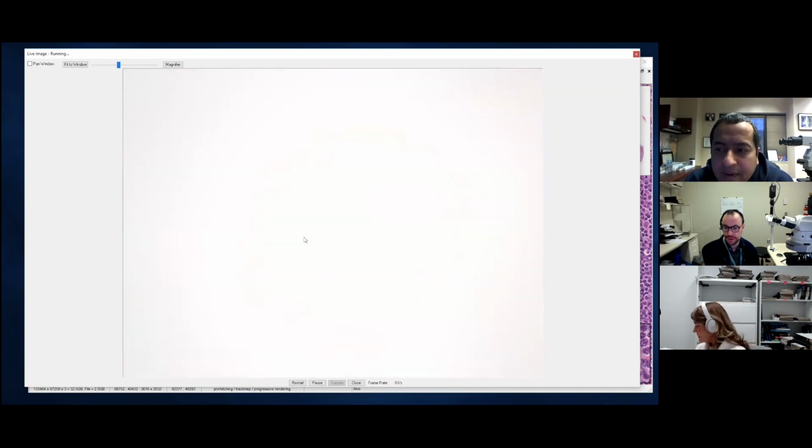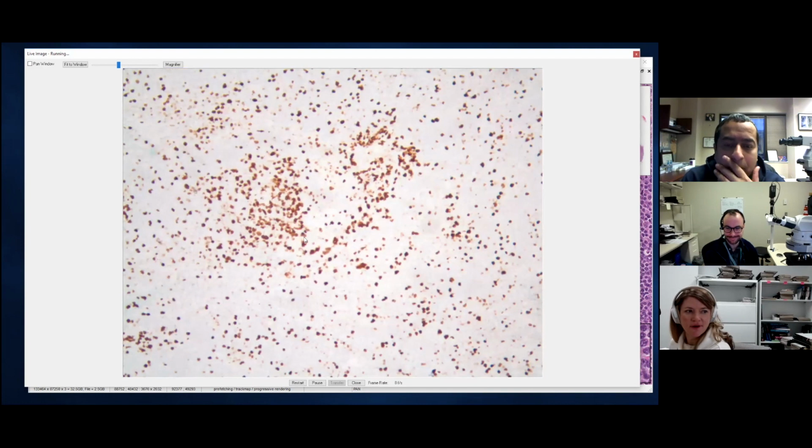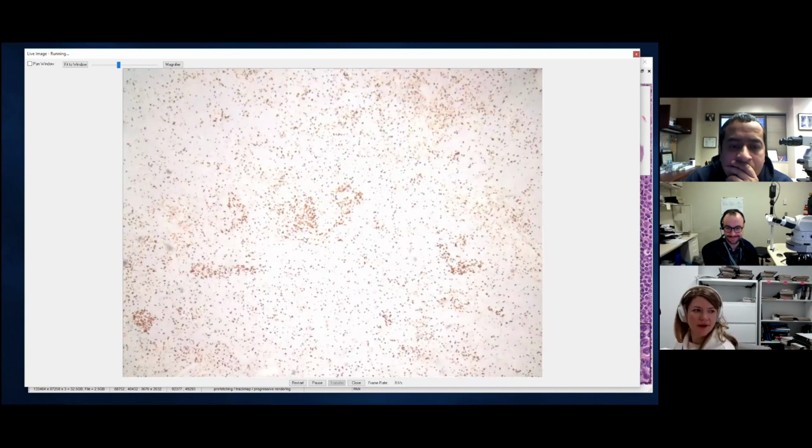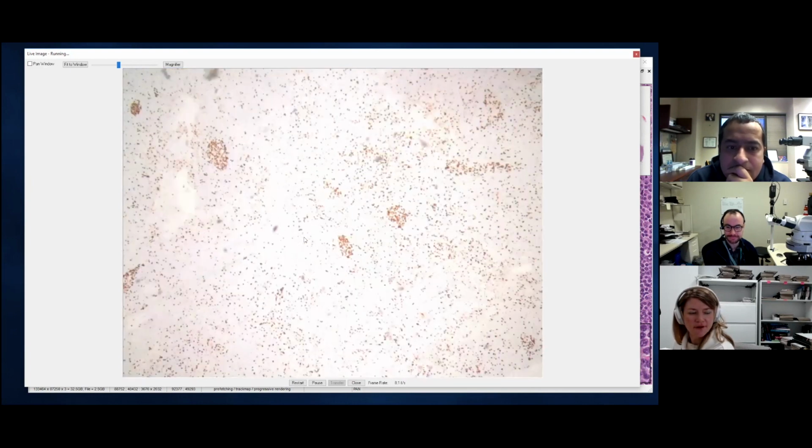Yeah, I think it's helpful just for trainees to know that you can have reactive looking germinal centers in lymphomas of various kinds, whether they are part of the tumor or overridden by the tumor. But just because you have an occasional reactive looking lymphoid follicle doesn't mean the whole thing is benign, right, Eve? Yeah, no, I find that really helpful to look at, and the other thing that comes into that is Ki67, to say, hey, are there reactive germinal centers in here? Because that'll pick them up easily, and the ratio of how they look compared to the other.